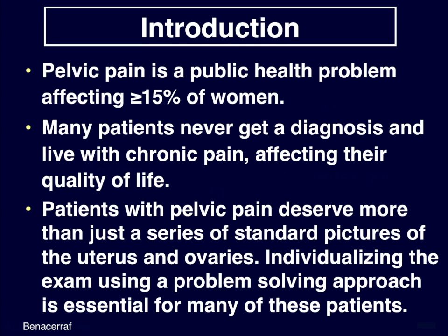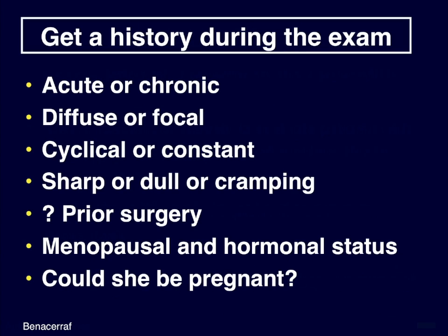Patients with pelvic pain deserve more than just a series of standard pictures of just the uterus and the ovaries. You have to individualize the exam because these patients present with a problem, and we have to be problem solvers in approaching these patients. And that approach is essential for finding the cause of pelvic pain.